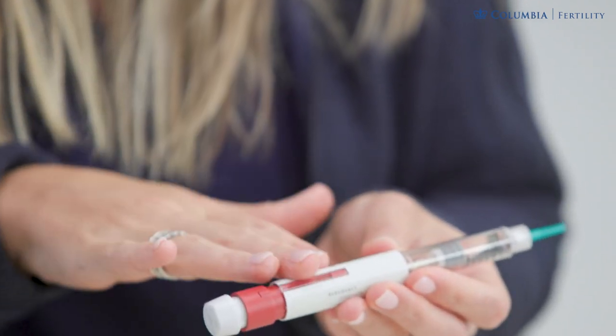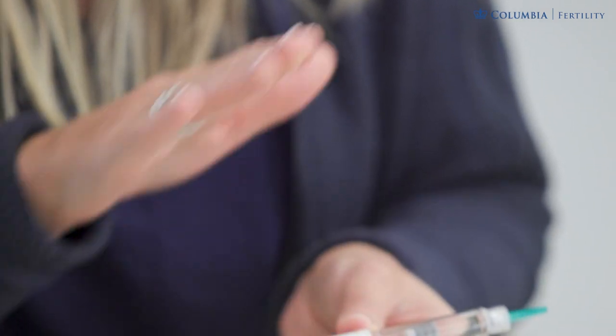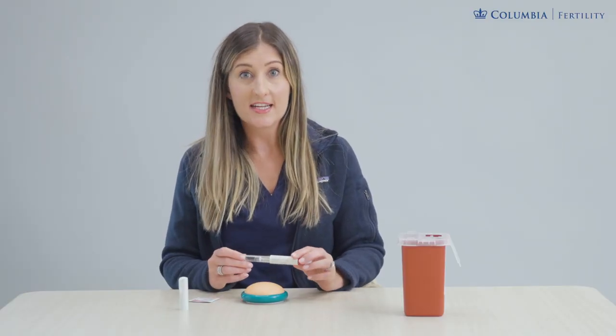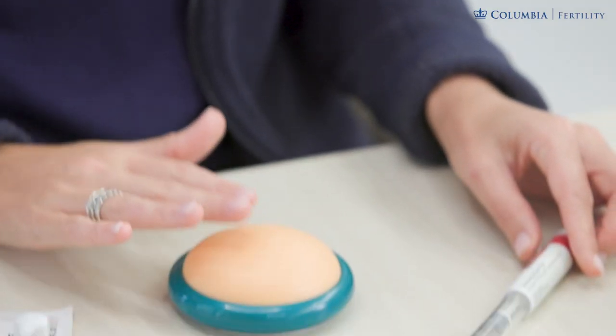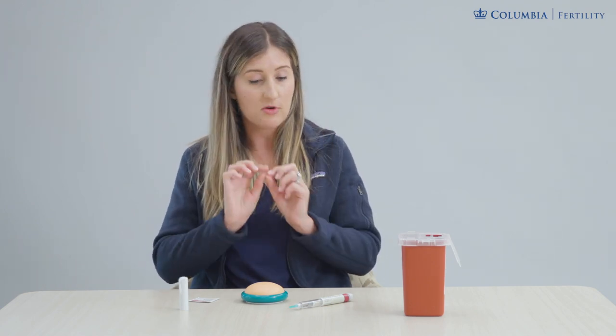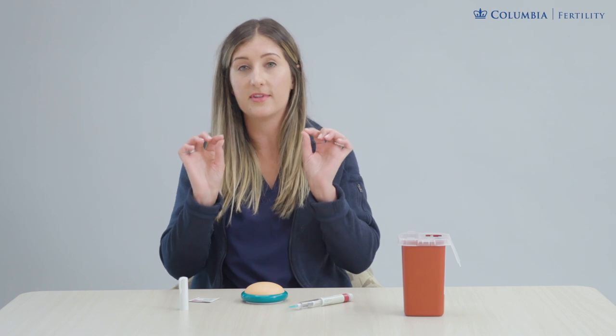The dose is now dialed up and confirmed. The needle tip is on and we're ready to inject tonight's dose. We're going to use the abdominal injection site, which is the preferred site. You're measuring about one to two fingers' width away from the belly button, or about one inch away. Imagine a U-shaped area of skin around the belly button — left, right, or bottom — that's all safe and fair game for this injection.